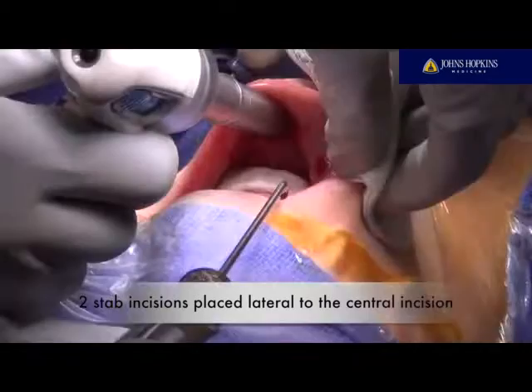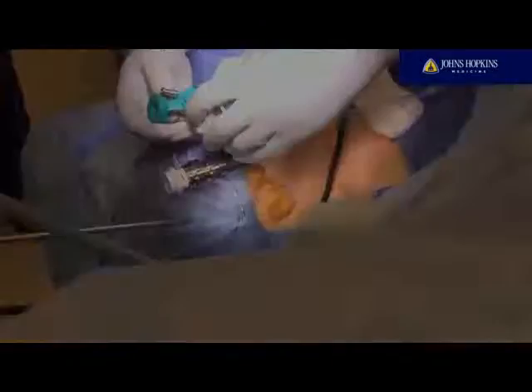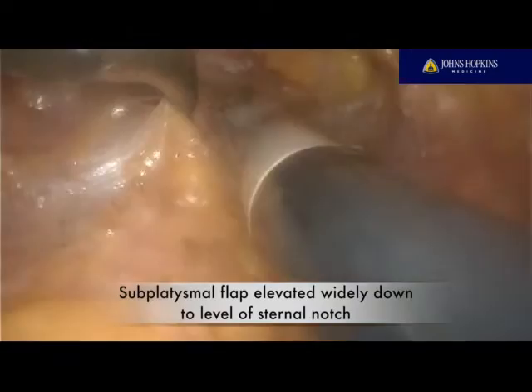Stab incisions are then placed through the lower lip and the vestibule for the lateral ports. Hydrodissection is performed again with dilute saline, and the lateral cannulas are placed anterior to the mandible into the subplatysmal space. Dissection is initiated with standard laparoscopic instruments.